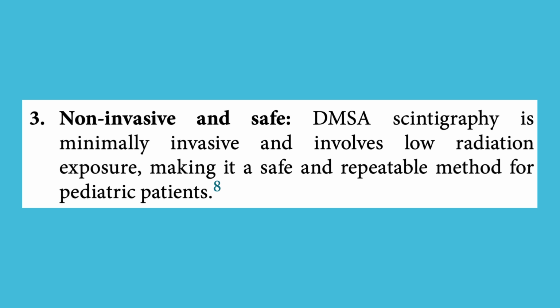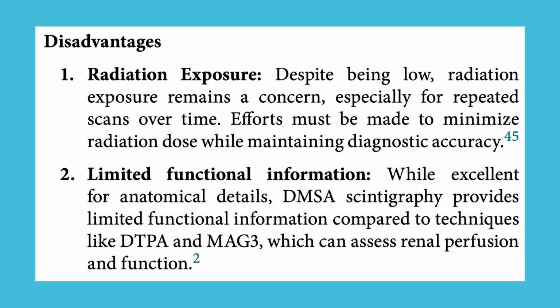DMSA scintigraphy is minimally invasive and involves low radiation exposure, making it a safe and repeatable method for pediatric patients. Disadvantages. 1. Radiation exposure. Despite being low, radiation exposure remains a concern, especially for repeated scans over time. Efforts must be made to minimize radiation dose while maintaining diagnostic accuracy.